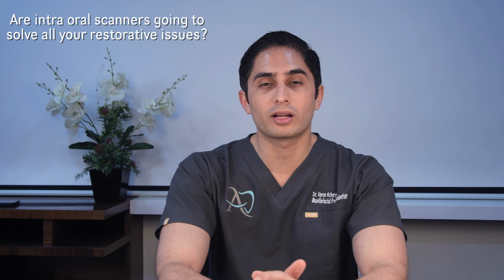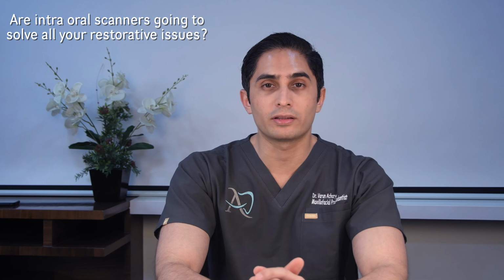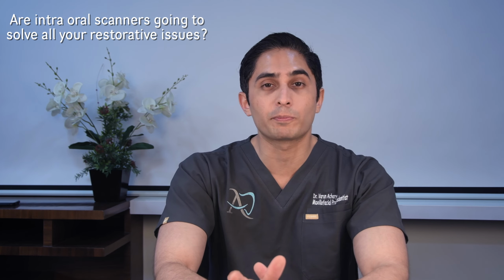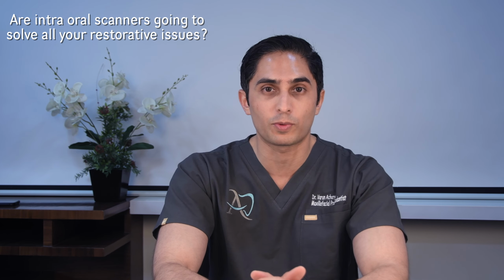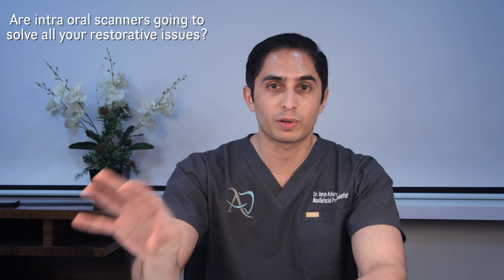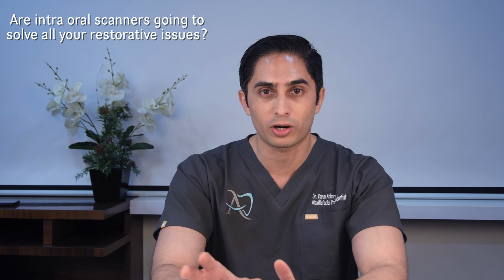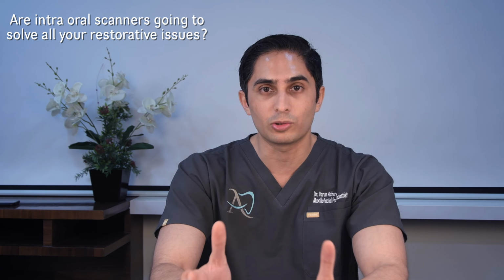Now, you might think that if you're struggling with regular analog impressions using your putty and light body or your polyether or any other type of material, that an intraoral scanner is just going to make life so much easier for you. I don't think that's true. You need to really refine your skills and up your game with regular analog impressions. You need to understand how to retract the gingival tissues properly, how to prep your teeth properly, how to give good provisionals. The scanning is the very last part of it. Same way the impression is the very last part of it. So if you're struggling with regular impressions, your intraoral scans are not going to magically give you a better product, because the scanner is very, very dependent on what you see, because after all, it's light doing that impression for you.